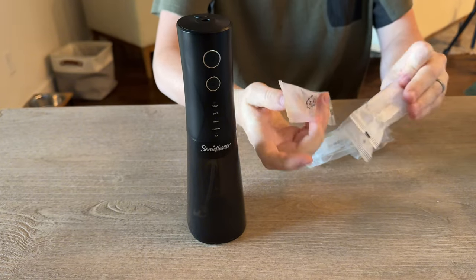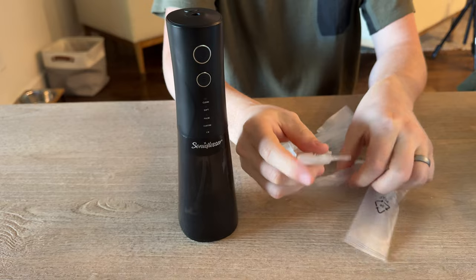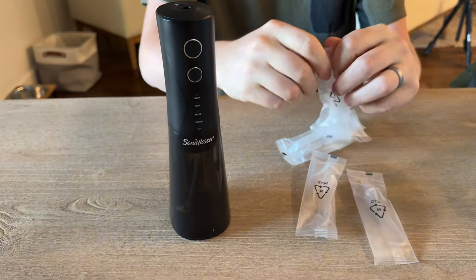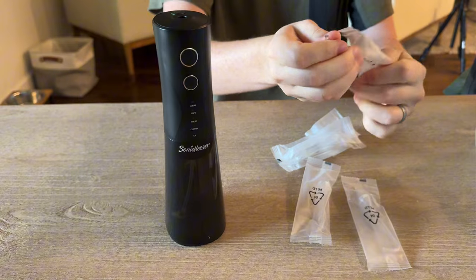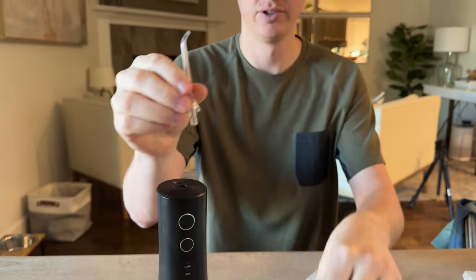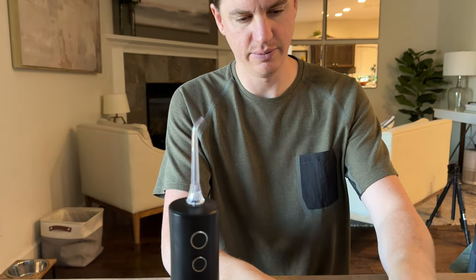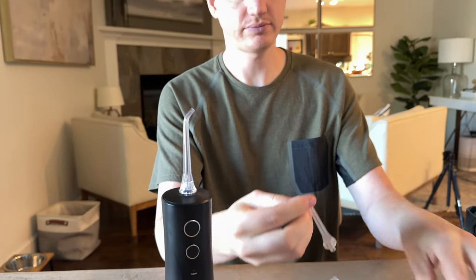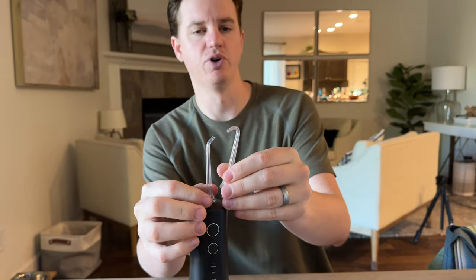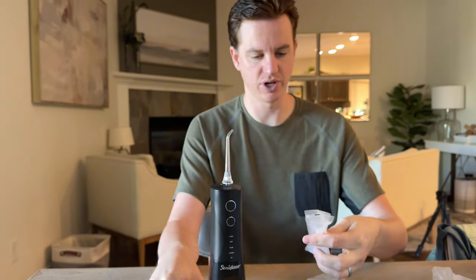So it comes with multiple floss points or tips, which is really nice. I'll open these up so you can see what they actually look like. They have different angled tips — this one's a curved one, and this one has more of a curve. So depending on where you're trying to floss in your teeth, you can have different points depending on which one you're trying to use.